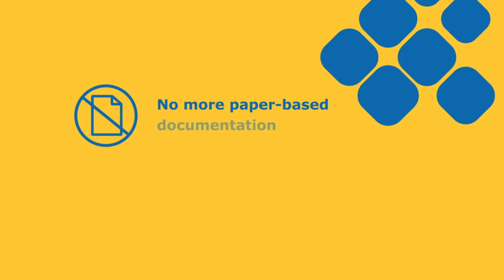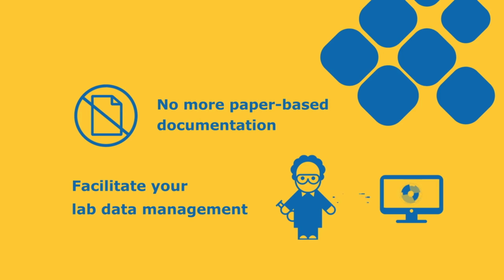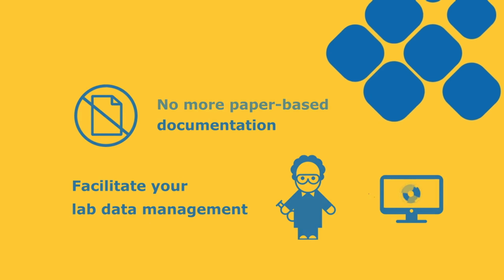No more paper-based documentation. Instead, improve data recording and reviewing efficiency and facilitate your lab data management with advanced connectivity and integration into your existing lab IT environment.